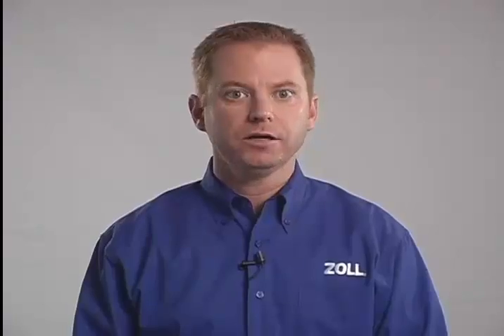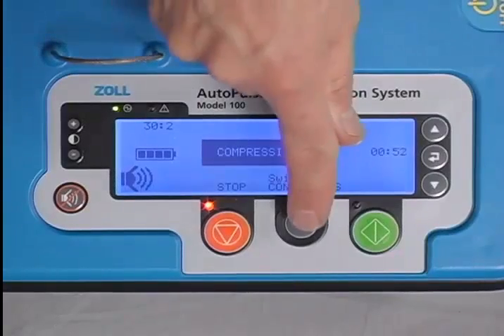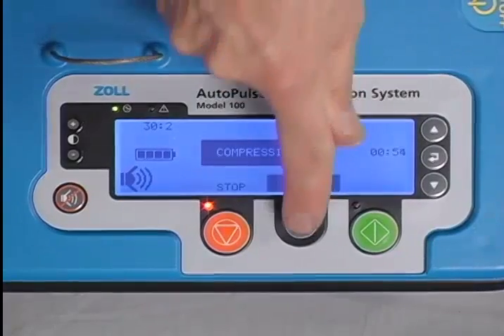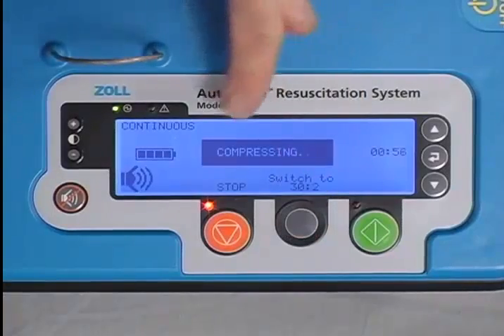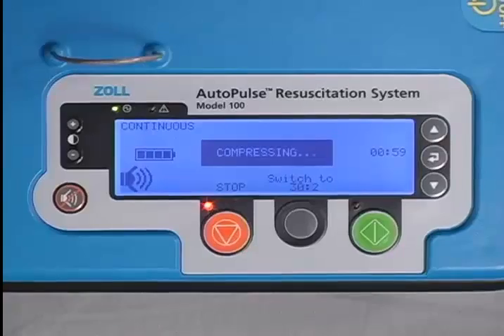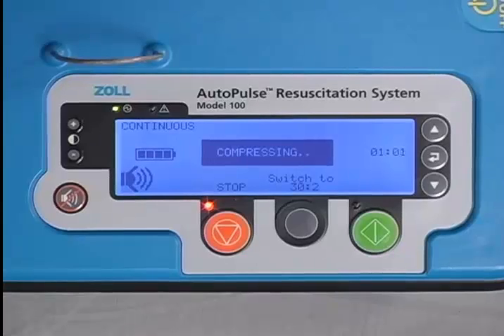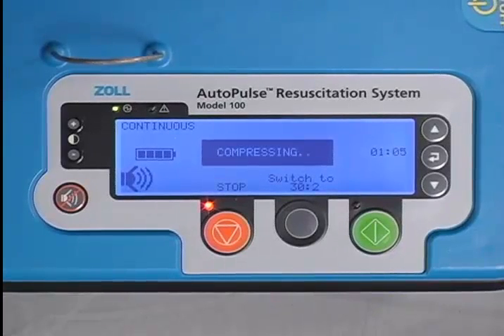For advanced life support, once the patient is intubated, it is very easy to switch on the fly to continuous compression-only mode. You simply press the gray Switch to Continuous button once and then immediately a second time within 2 seconds to confirm continuous mode. Once continuous mode is activated, you will hear a confirmation tone and the word "continuous" will replace "30 to 2" in the upper left-hand corner of the user display.